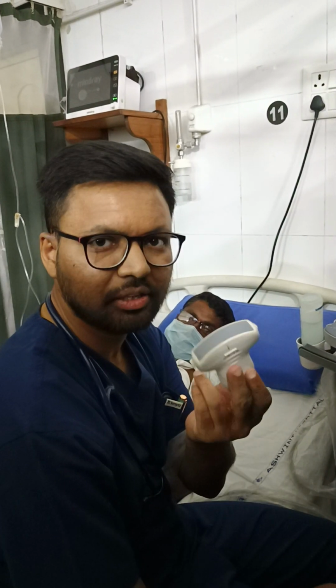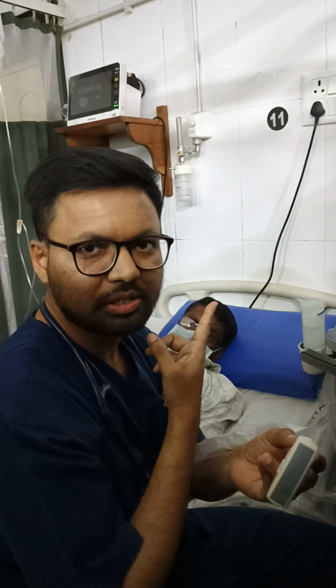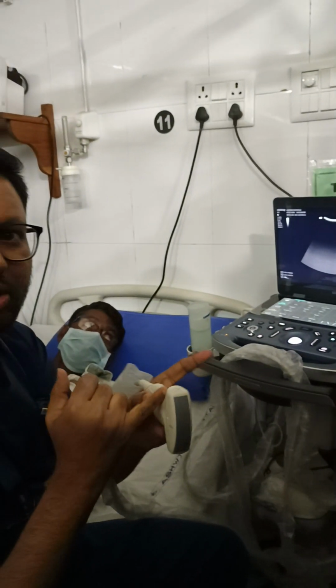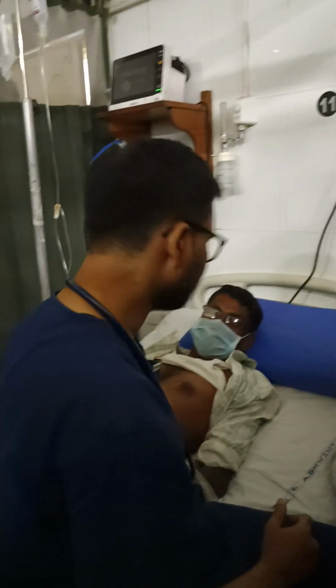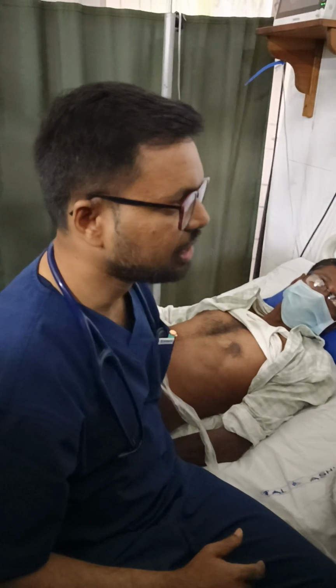So first I am picking the curvilinear probe and pointing the pointer to the cephalic end of the patient so that the marker matches with the pointer. So I am placing the probe in the infraaxillary space with the pointer towards the cephalic end.